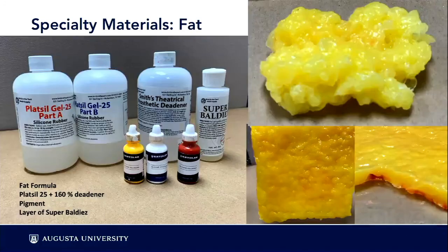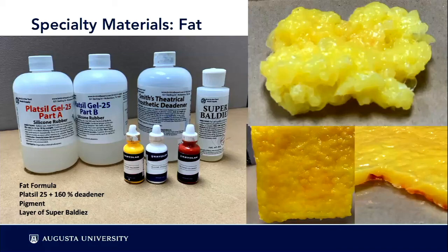The other special effects material is for fat simulation. The recommendation is Platsil 25 with a deadener added — when you add deadener it essentially inhibits the cure of the silicone, making it very soft and sticky. You then have to encapsulate it in a material called Baldies, which is a bald cap material. I'll pass it around so you can touch it — it provides a lot of realism for the simulation model.